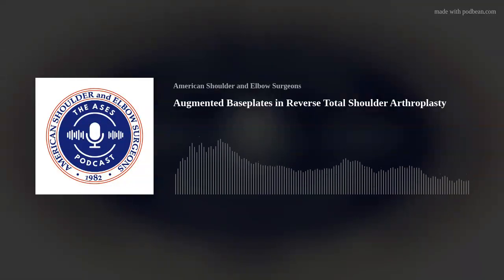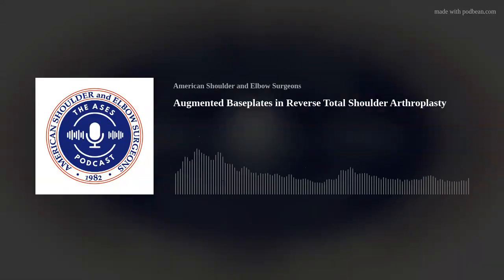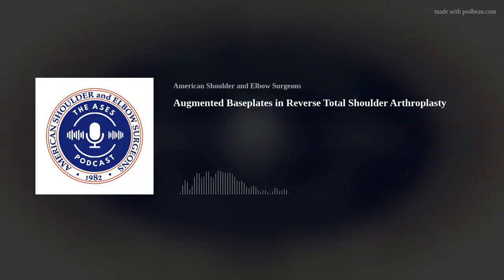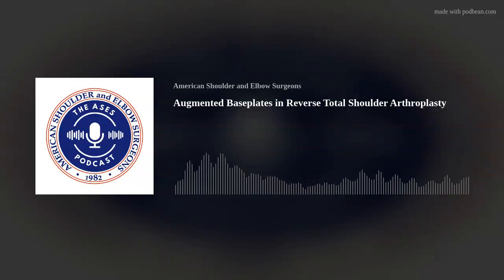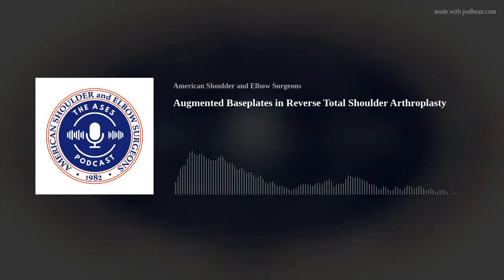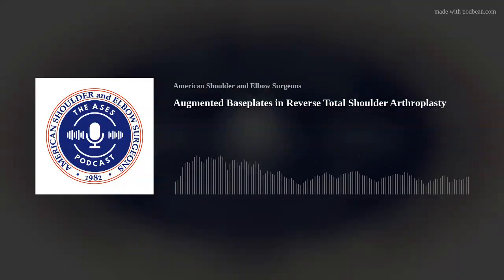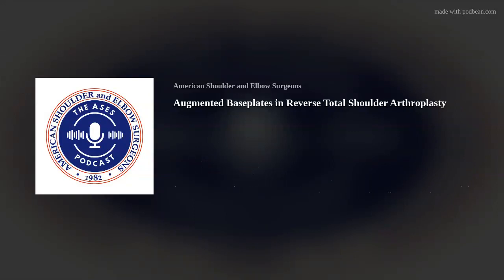If it's a severe deformity, then I'm getting a custom. To just Chris's point, I think it relates to that specific system, though. So I guess there are so many different variables, right? When we start looking at every system, if you're using that particular system now in your cases, then it makes sense to use augment almost all the time. But otherwise, it's not apples to apples, really.